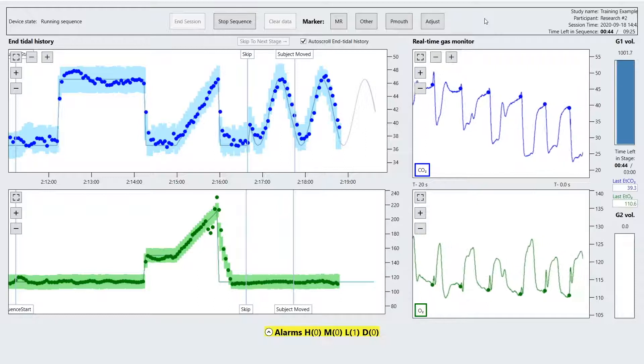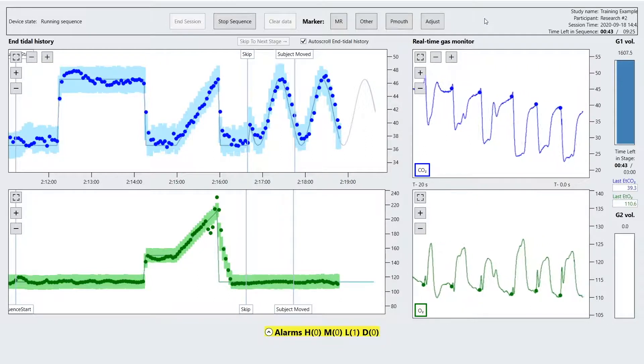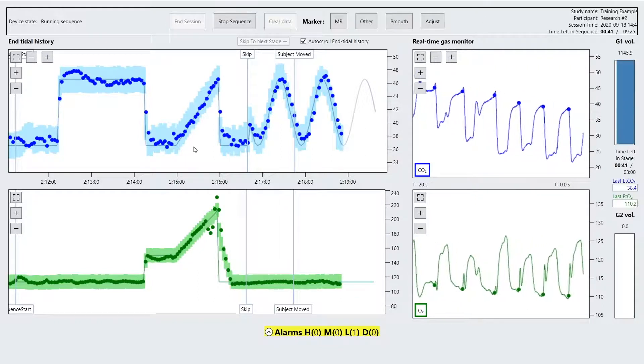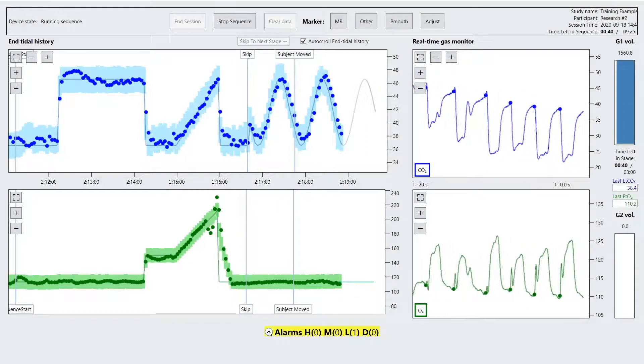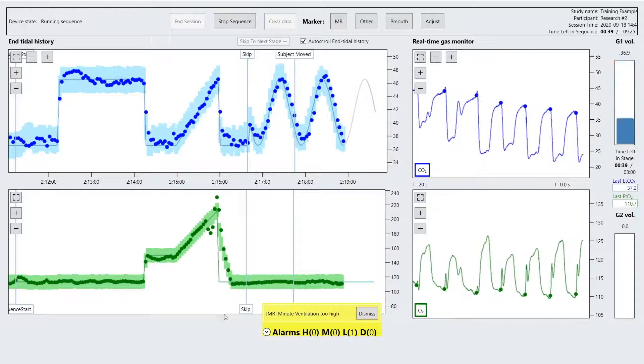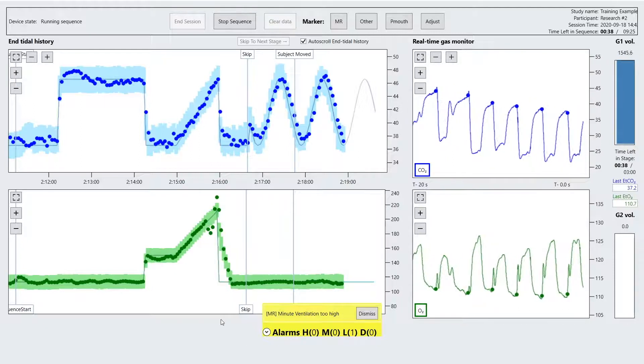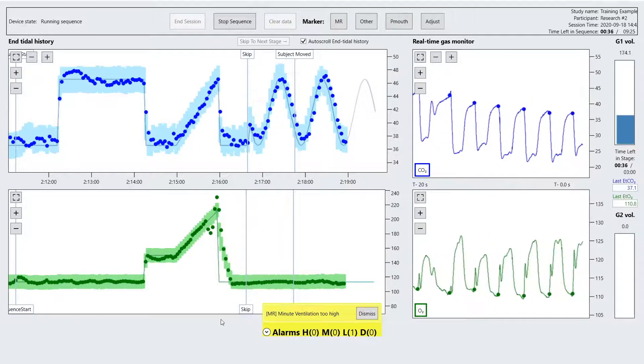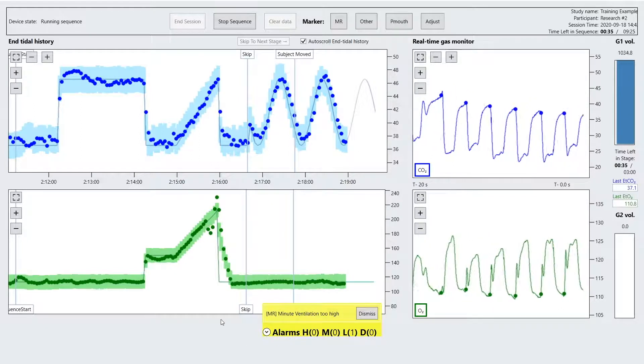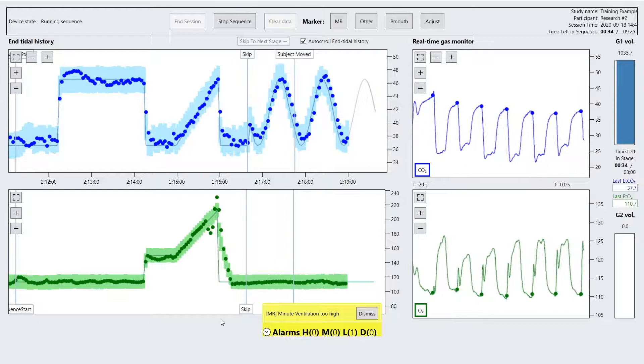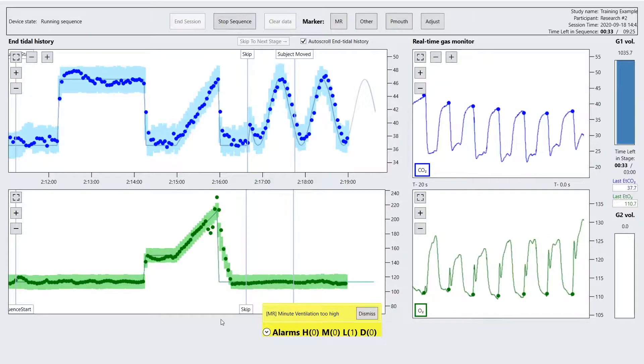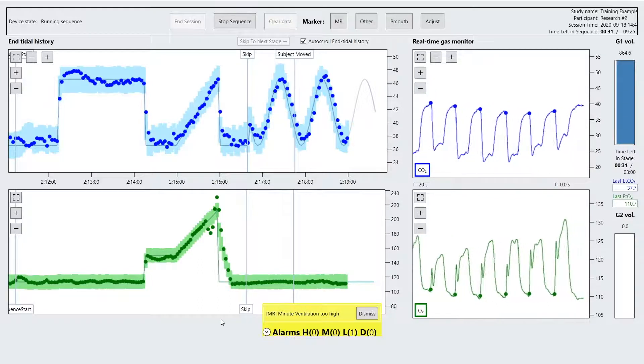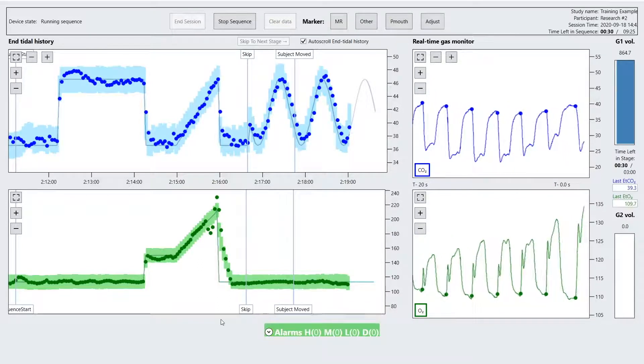Yellow is a low to medium priority alarm which serves as a warning for events such as high subject minute ventilation or tidal volumes. A red alarm is a high priority alarm which stops the sequence from running and thus the subject is free to passively breathe room air.